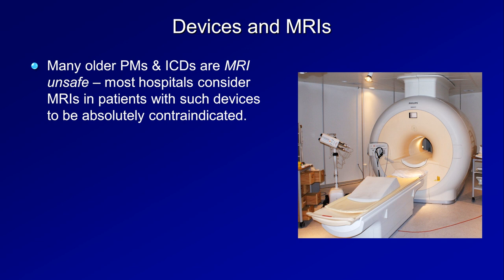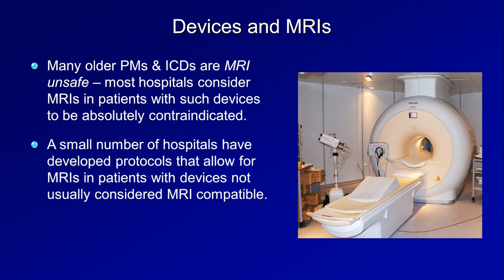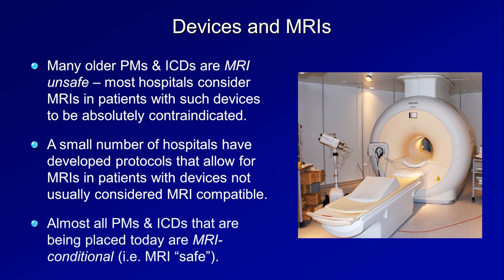However, the risk of harm is much lower than previously thought if special precautions are taken and the patient meets other criteria. Thus, a small number of hospitals have developed protocols that allow for MRIs in patients with devices that are usually not considered MRI compatible. Almost all pacemakers and ICDs that are being placed today are labeled MR conditional, which is commonly assumed to mean they are MRI compatible or MRI safe, though the device companies don't like that terminology because there is still a very small but non-zero risk of the aforementioned complications.